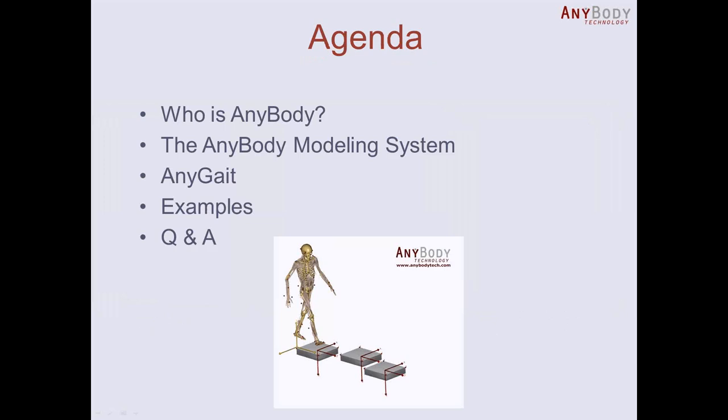Very briefly, I'm going to start to tell you who is AnyBody. Then I'm going to explain the AnyBody Modeling System. Then I will go to the key point today. I will explain the Gait application called AnyGait. I will show some examples how to use this application. And then finally, we will have time for some questions and answers.